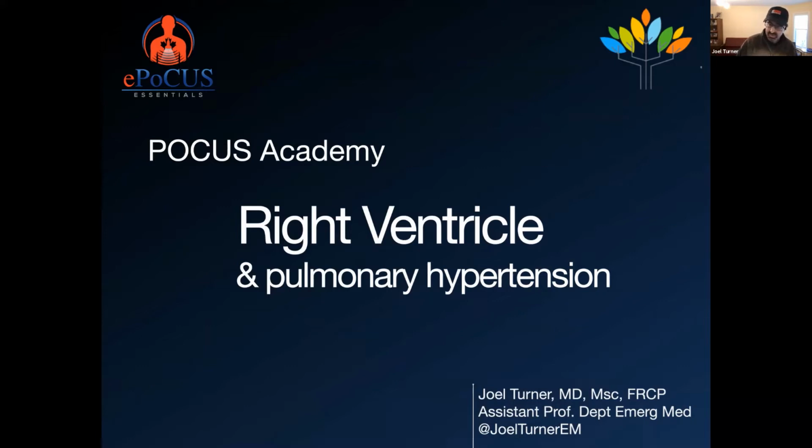I'm going to talk for the next 30 minutes very quickly about the right ventricle and about pulmonary hypertension. This is maybe a little bit more of an advanced talk, but I hope that even those who don't have experience doing this type of assessment can appreciate, when they read cardiac echoes, what the language of the cardiologists and echocardiologists is and how they are assessing the right heart.